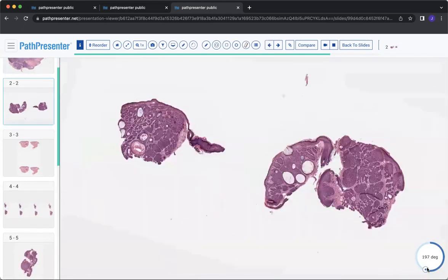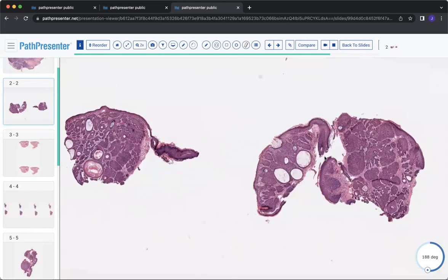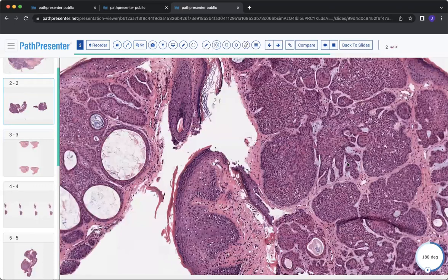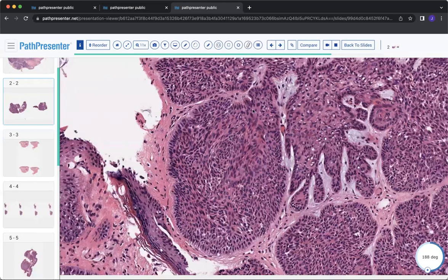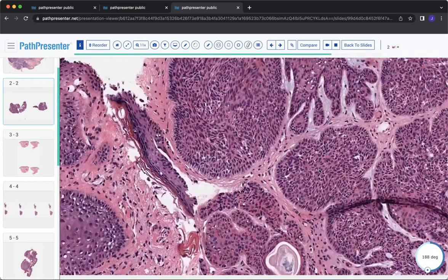Moving on to the next entity here. So in contrast to the last example of a trichoblastoma, you can definitely tell that this neoplasm is much smaller. As you go on higher power, you'll notice these basaloid islands again. They're taking up a lot of hematoxylin. There's some areas of peripheral palisading as well. And I hope you appreciate that the stroma is pretty tightly adhered to these outside basaloid islands.